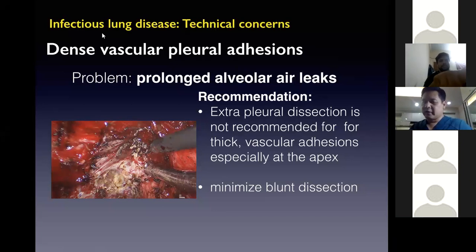Yes, you are. Okay, so we try to minimize blunt dissection, especially for those dense vascular adhesions, to minimize bleeding and air leaks.